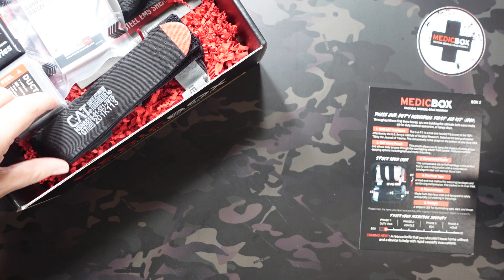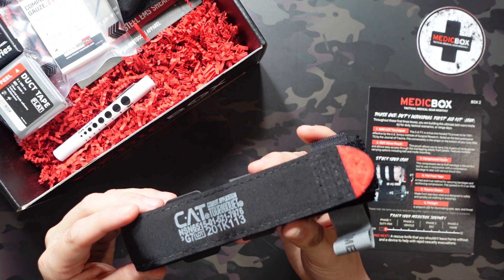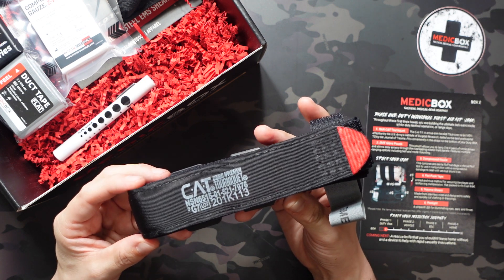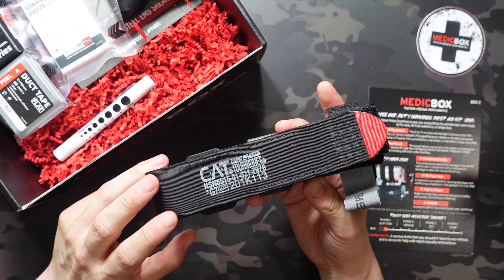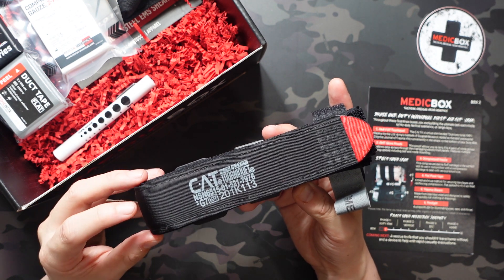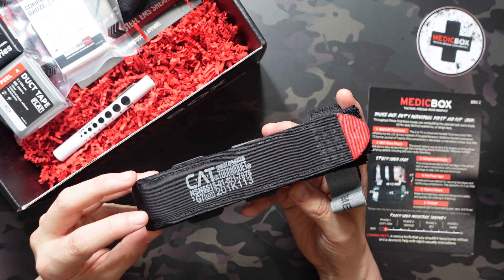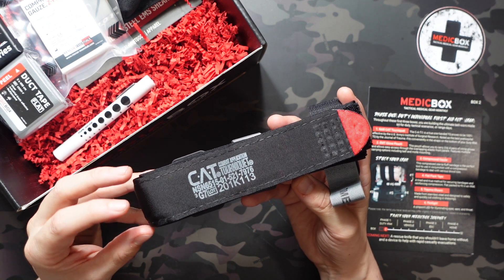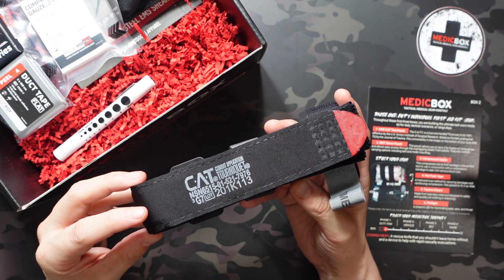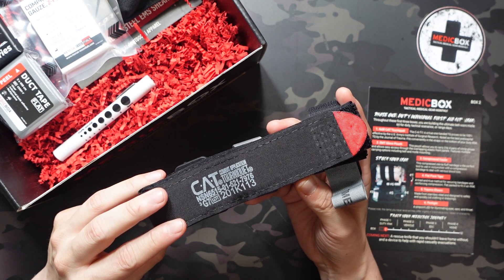Going in order of how they list it — up first we have the NARCAT tourniquet. Love seeing this in here; it's essential for any trauma first aid. This is for stopping arterial bleeds on any of your limbs. It's one item that's sometimes overlooked — everyone knows it's essential, but it's a little expensive for a first aid kit, so some people skip out on it to save money.